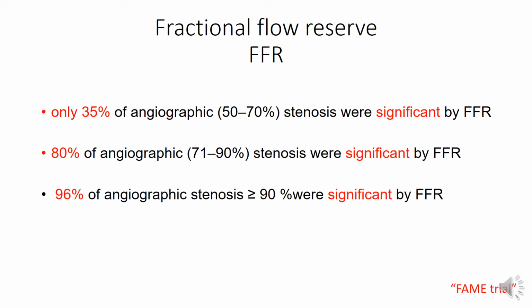So what if I don't have FFR in my cath lab? How accurate is my angiographic evaluation of the lesion? Data from the FAME trial give us insight about this question.